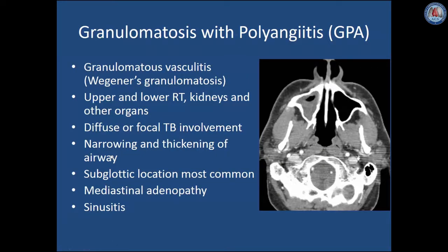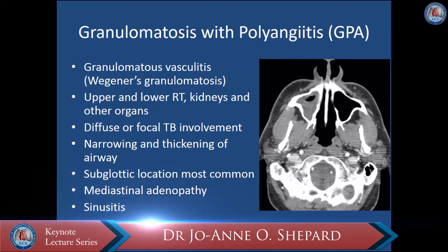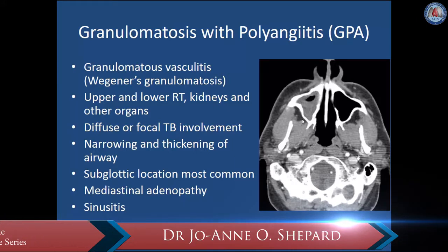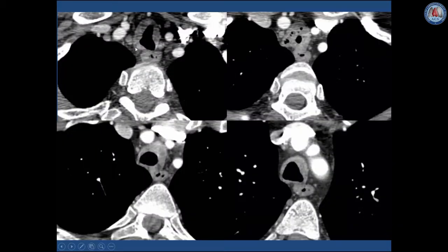Granulomatosis with polyangiitis, otherwise known as Wegener's granulomatosis, is a granulomatous vasculitis that has a propensity to involve the upper and lower respiratory tract, kidneys, and other organs. There can be diffuse or focal involvement of the trachea and bronchi, and narrowing can occur as a result of diffuse thickening. Subglottic location is the most common area of involvement, although any site can be affected. There may be associated mediastinal lymphadenopathy and sinusitis. In another patient with GPA, one can see diffuse circumferential thickening of the proximal trachea extending inferiorly into the mid-trachea.